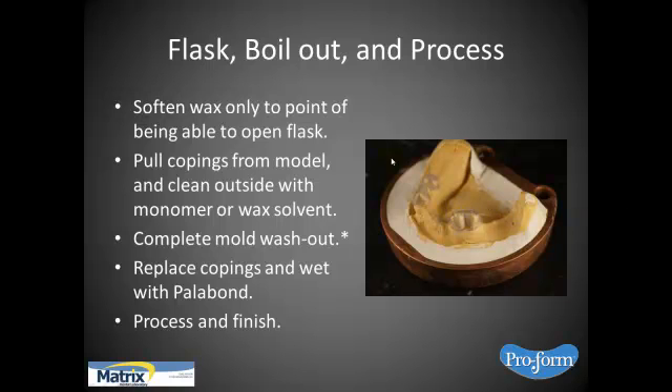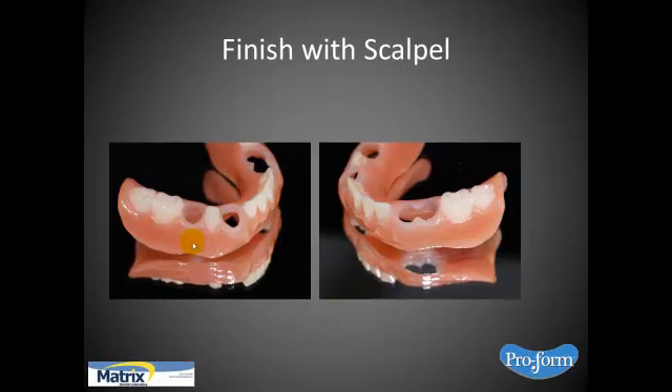Finishing is nothing more than taking a scalpel and cutting the tops of the copings off, and using some rubber wheels for the interface along the top to get it smooth. Then finish with the scalpel, and polish and finish like you ordinarily would. Some people have asked if you should put a gloss sealant on there — I don't. I guess you could, but it's a gasket, it's going to have saliva all over it. If you're looking for aesthetic appeal there, you're still going to see the gasket. And if this flexes and you have a hard sealer on there, I believe it'll just flake off.